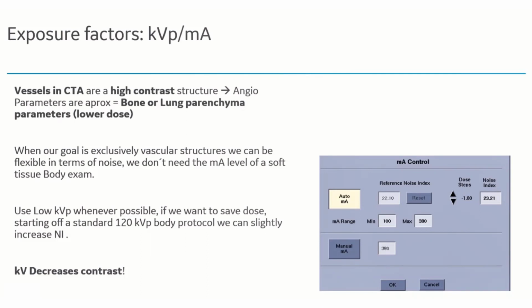So the system will work close to the minimum mA to reduce the dose and increase the noise index.